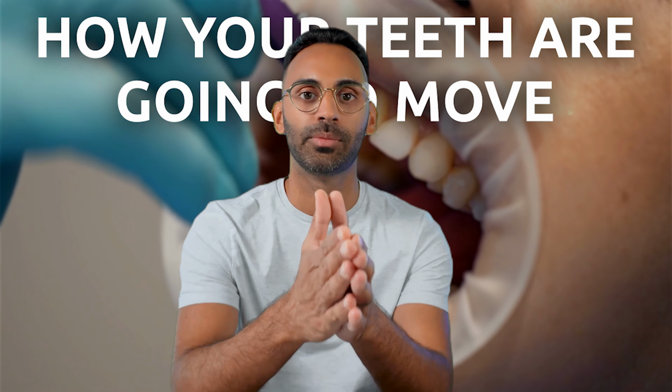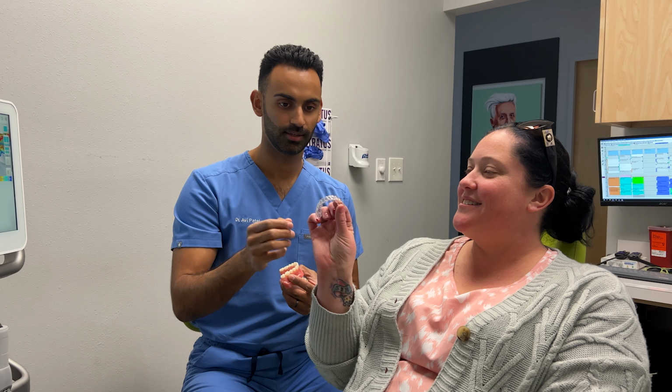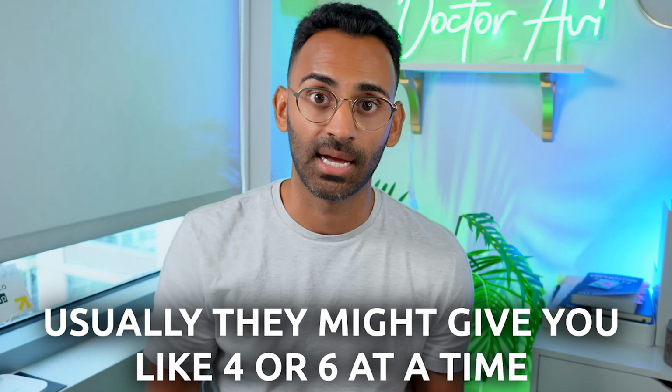Have you ever wondered how often you should see your dentist when you're wearing aligners? Piece 3 to the puzzle is going step by step. After your records are taken, after the plan is already made, you are going to come back and see your dentist, and they are going to give you your aligners. Some dentists give you all of them, and others will give you your aligners in phases. Usually they might give you like 4 or 6 at a time and have you come back. So now that you have your aligners, you're going to go home and switch them out every week. Anytime you put in a new one, that aligner is going to start to gently nudge your teeth. This is how aligners work. I'm going to dive into it a little bit deeper in a sec.